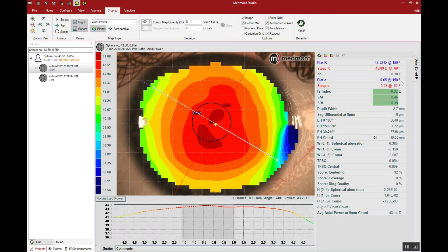Another indicator is the eccentricity. Previous research has shown that the higher the eccentricity, the better the potential for ortho-K. The lower the eccentricity, the harder it'll be to squeeze out higher refractive changes. The median E-value with your Medmont is about 0.65 — that's the normal rate of flattening in the middle of the bell curve. If this patient's eccentricity is higher, that indicates a better candidate. If the E-value is lower, it may be harder to achieve the orthokeratology effect, especially on higher refractive changes.